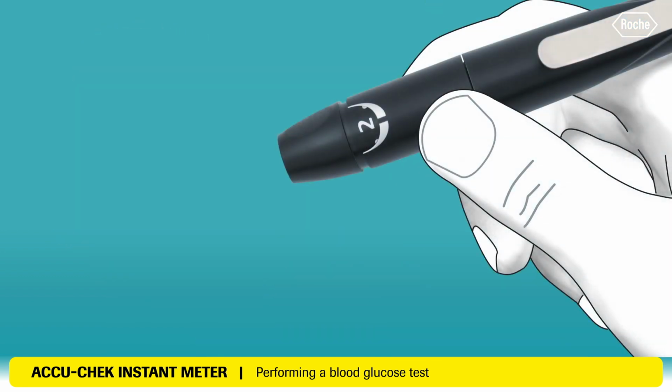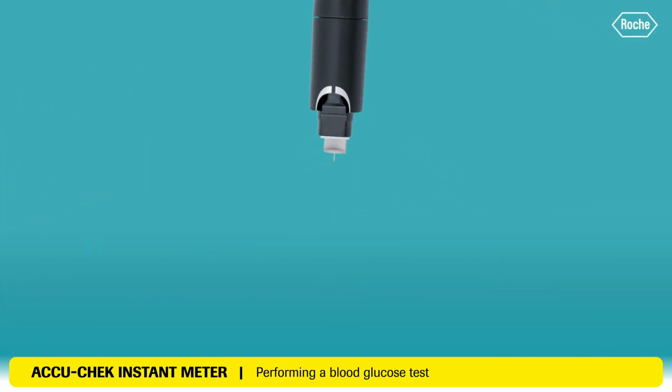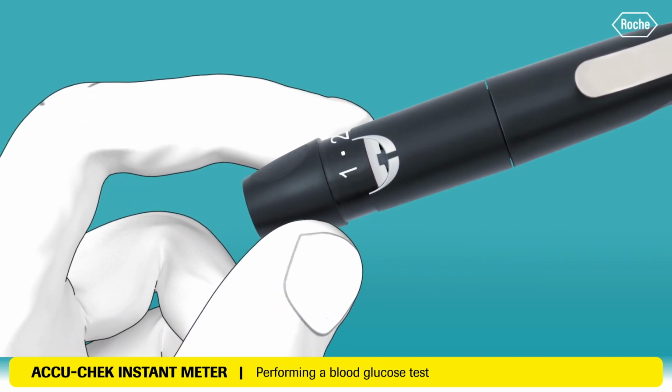To dispose of the lancet, remove the cap from the lancing device. To remove the used lancet, point the lancing device into the sharps container and eject the lancet by sliding the ejector forward as shown. Then put the cap back on the lancing device.